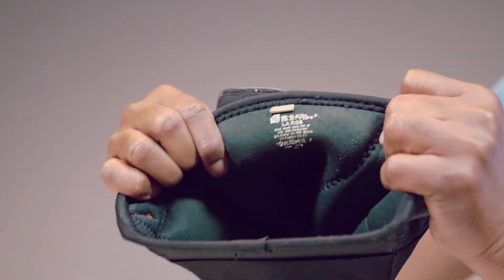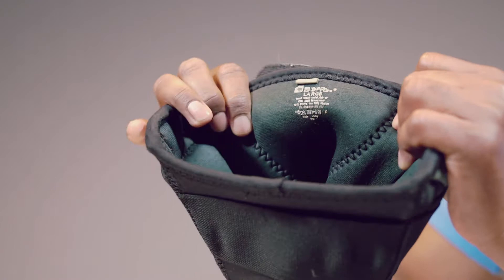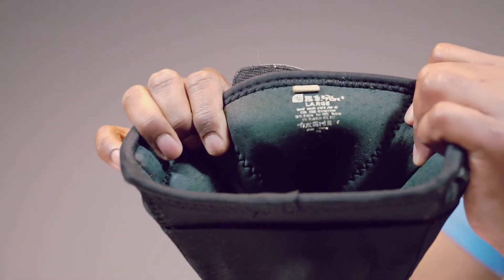Please make sure you get the correct size according to the size chart provided under the product description. This one is large.